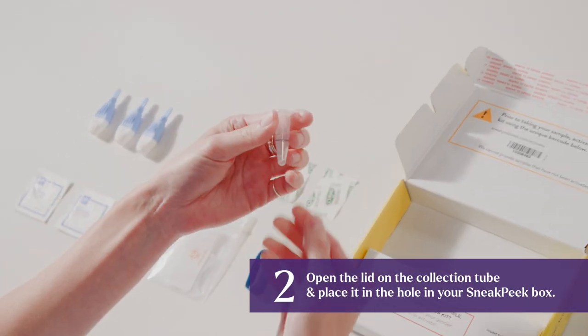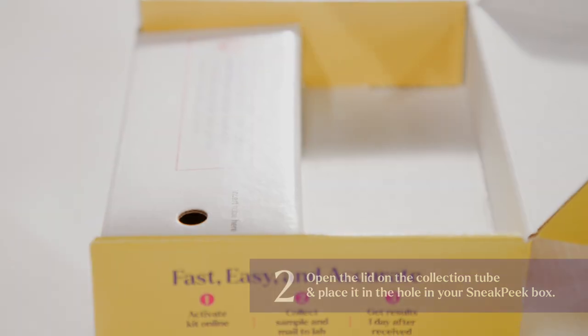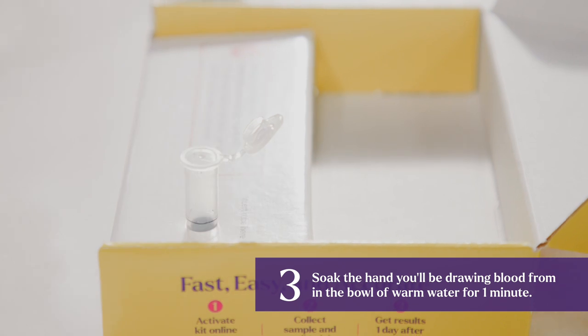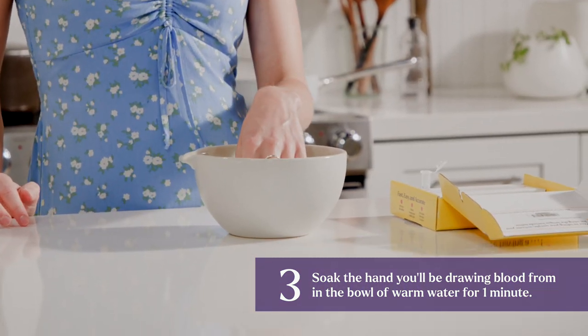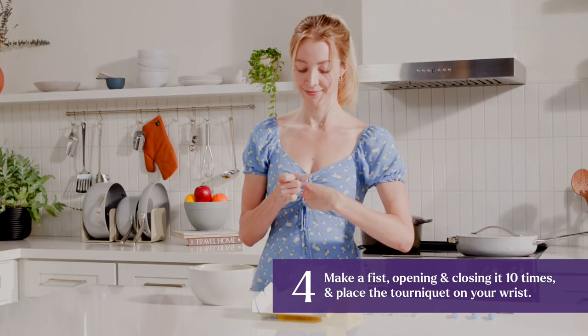Open the lid on the collection tube and place it in the hole in your Sneak Peek box. Soak the hand you'll be drawing blood from in the bowl of warm water for one minute, then make a fist, opening and closing it ten times, and place the tourniquet on your wrist.